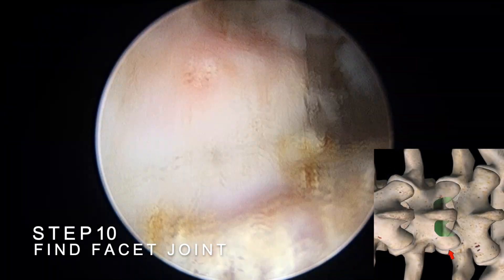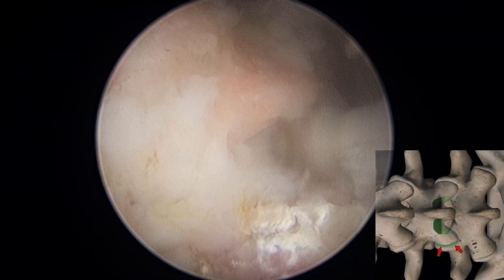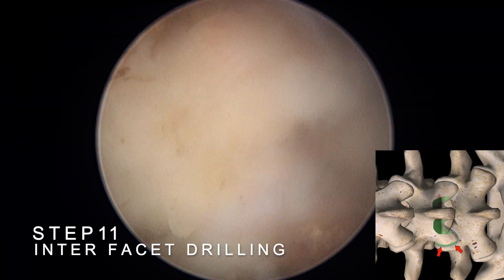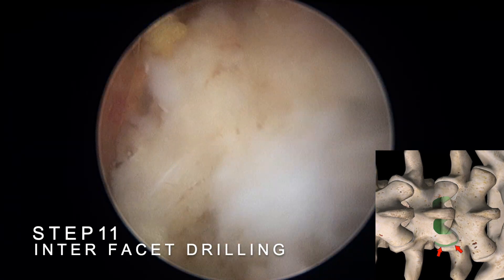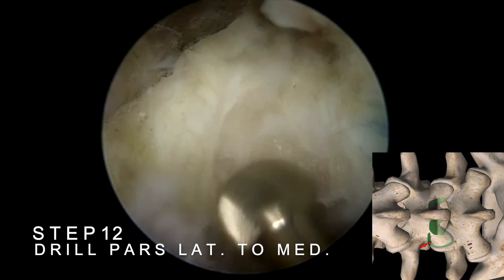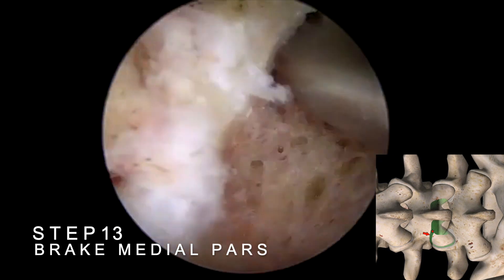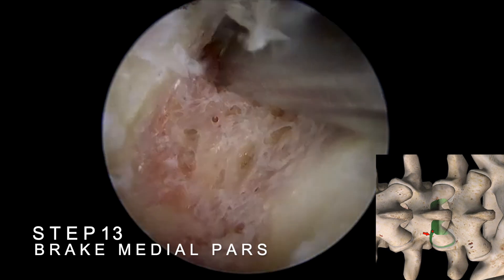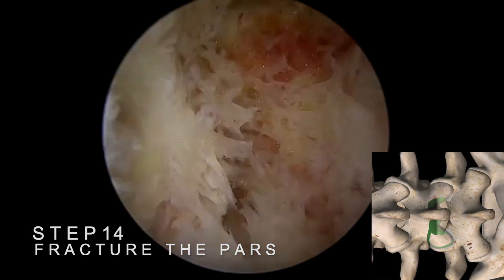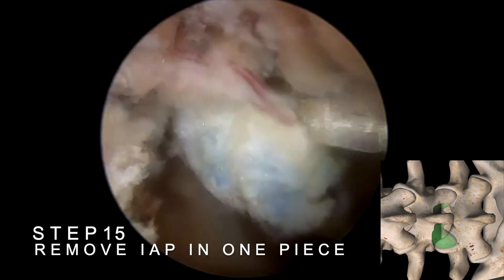After successfully mobilizing the ligamentum flavum on the contralateral side, we return to the left side at the facet joint. Use a high-speed burr to perform inter-facet drilling, separating the joint surfaces of the inferior articular process and the superior articular process. Drill from the pars interarticularis, moving from the lateral to the medial side, until it meets the previously made laminotomy. Break the pars from the medial side, then use an osteotome to fracture the pars. The inferior articular process can then be removed in one piece.